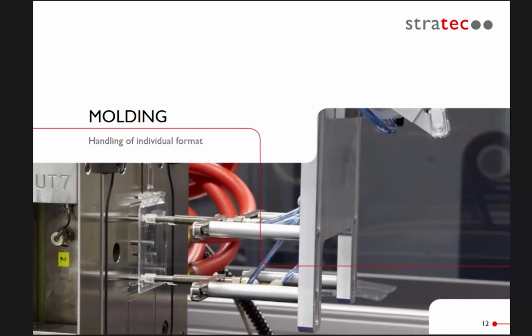And for prototyping, you can mill your structures, your areas as you do it, of course. But if we go for mass manufacturing, we then, of course, build our dedicated molds, and we stop going from a disc. We have standard injection molding, we have variothermal molding, we have injection compression molding. We can combine all this, of course.